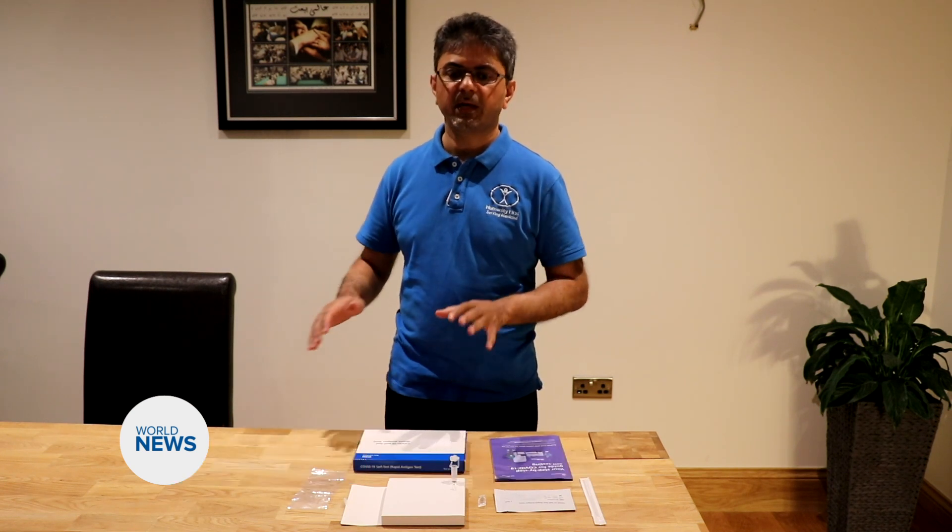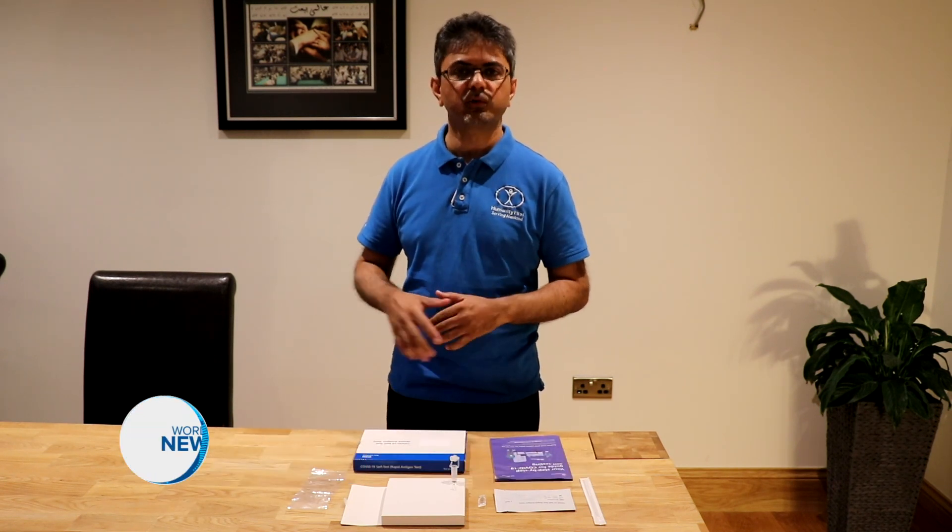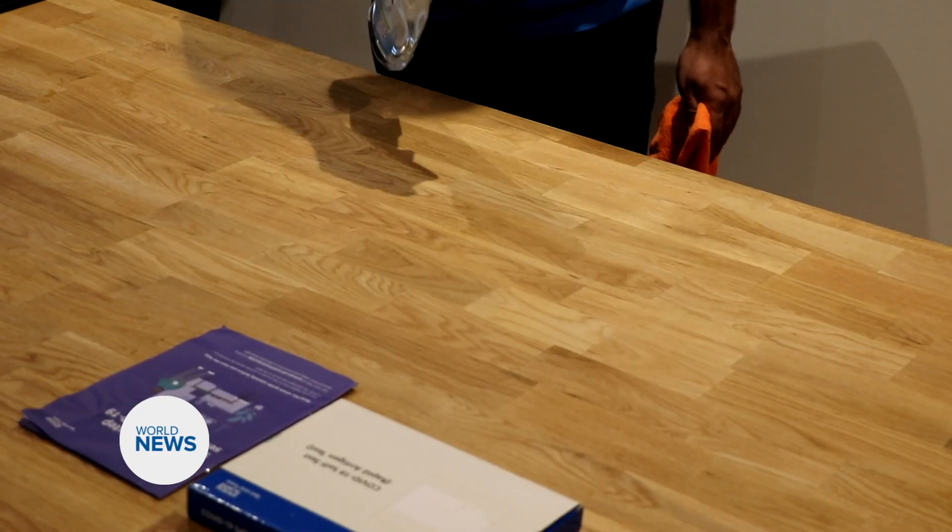First of all we need to find a flat surface which we need to clear and then clean with some disinfectant.